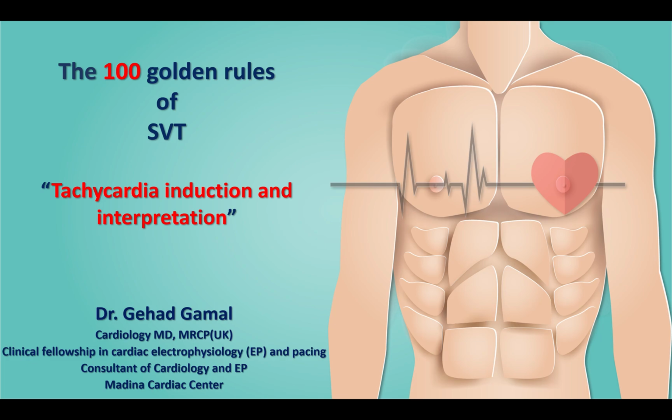Today I'm going to discuss tachycardia induction and how we can assess and interpret the tachycardia in an appropriate way. So let's start our lecture today.